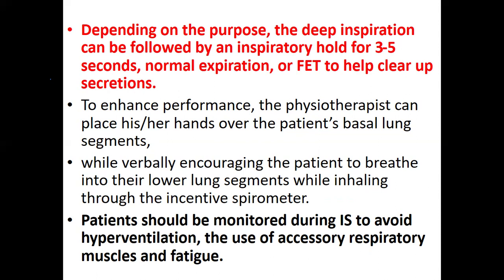Remember, we talked about diaphragmatic breathing when we were talking about traditional means of physiotherapy airway clearance. This one achieves the same as diaphragmatic exercises, but using the device. Depending on what you need, as we said in diaphragmatic exercises, you can couple them with a hold, normal expiration, or forced expiratory techniques, including a cough.